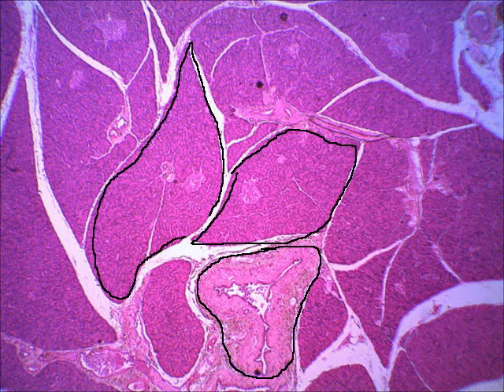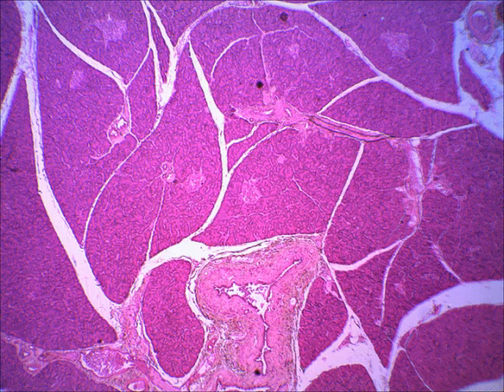Well, within each lobule, you've got two groups of cells. One group, which is by far the most numerous group, that's what you're seeing in all this dark pink areas. These clusters of cells are producing the pancreatic juice, which moves into little ducts like this one that lead into the big pancreatic duct.